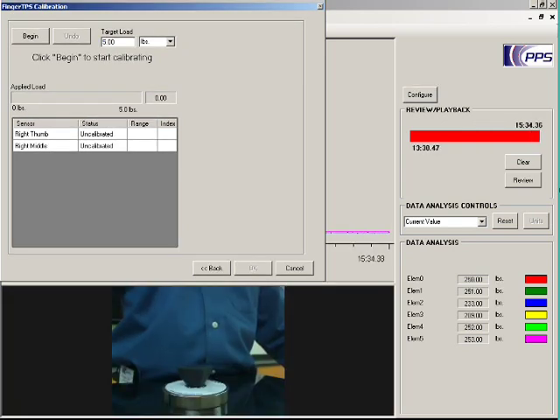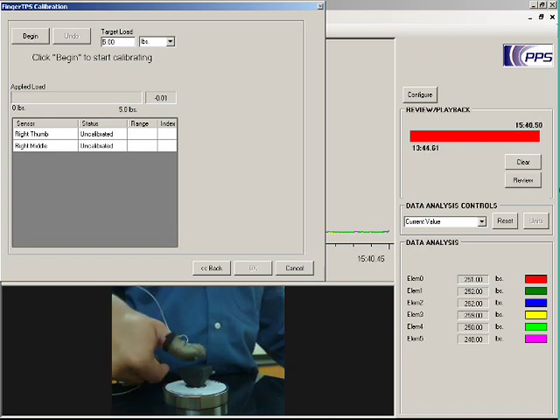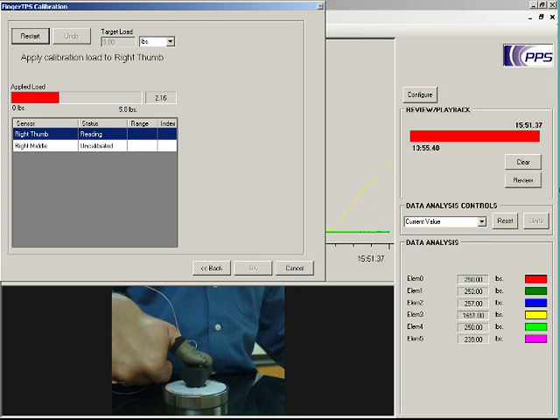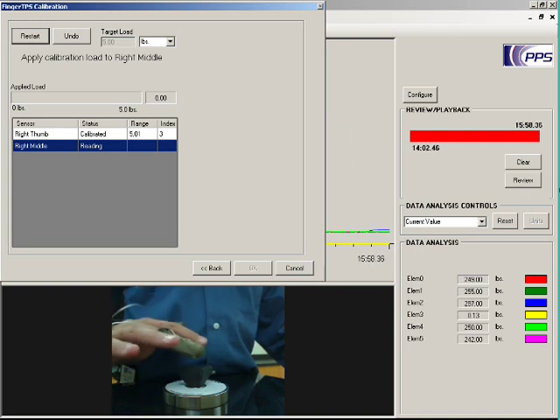We'll use the integrated video feature of the PPS software to watch what happens during calibration. The reference sensor records the actual force applied during calibration. I'll click the Begin button, and the software will walk me through the process. First, I apply the load to the right thumb, pressing slowly and evenly on the reference sensor until the bar turns green and the software directs me to release.